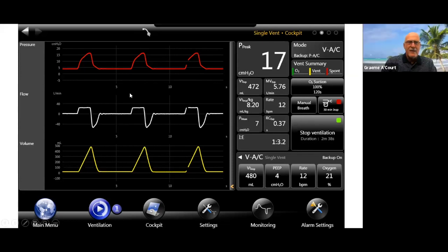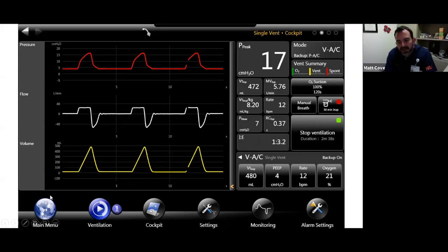That's right. Yeah, I mean, this is to me an undervalued measurement, which I can use a lot. Actually, that's quite a useful measurement, because one of the things I find is that sometimes you come along and there's been an obsession about maintaining a particular I to E ratio when the elastance is very high and the lungs are emptying out really fast. You actually don't really need to target that I to E ratio. And sometimes if you can allow the breath to be a bit longer, you preserve the airway pressures a little bit for a given volume.